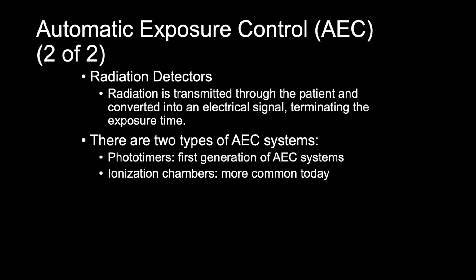Regardless of the type of AEC system used, all systems use a set of 3 radiation measuring detectors arranged in some specific manner. The radiographer selects the configuration of these devices, determining which of the 3, individually or in combination, measure radiation exposure reaching the image receptor. These devices are called the sensors, the chamber cells, or detectors. The radiation measuring devices are referred to as detectors.